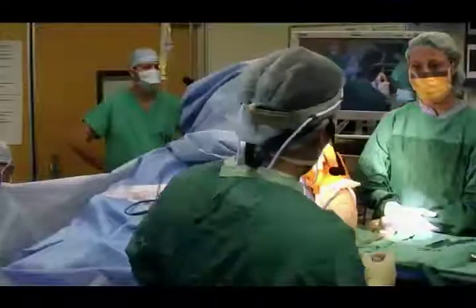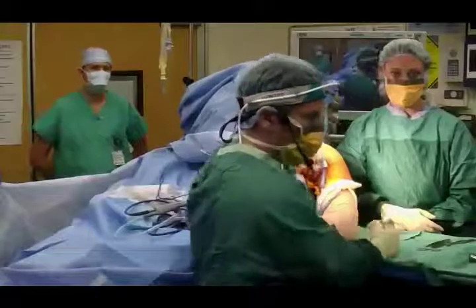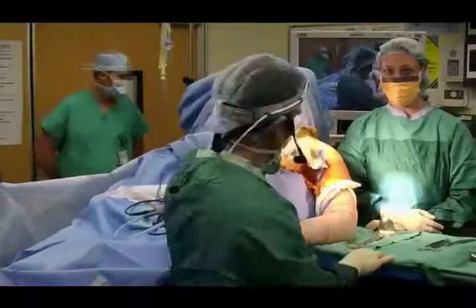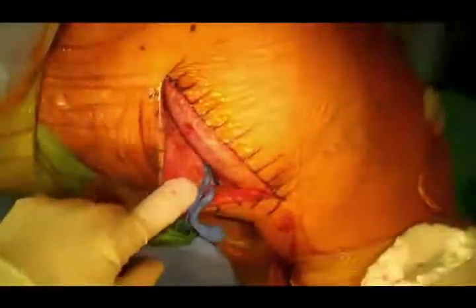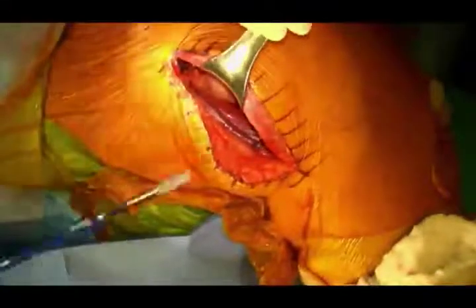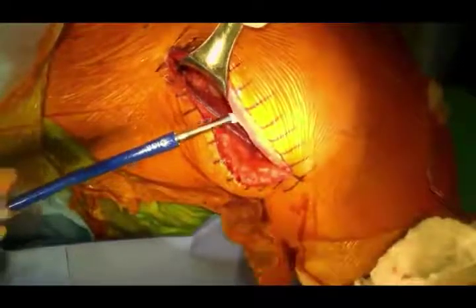This patient is a 59-year-old gentleman with classic rotator cuff arthropathy, massive cuff tear, a little bit of glenoid wear — not a tremendous amount — but he's a very large man. Because he's large, I got started a little bit early. This is a standard deltopectoral approach. I've already worked on the biceps a little bit.